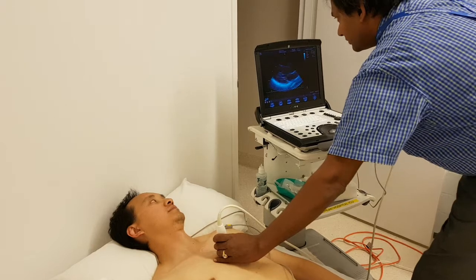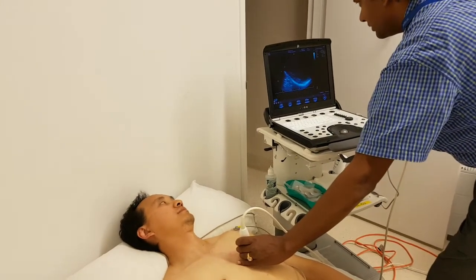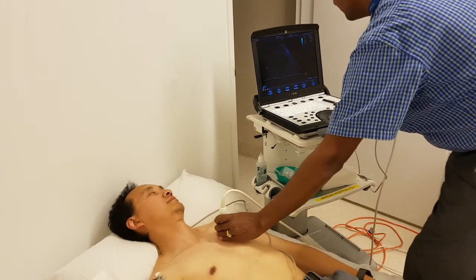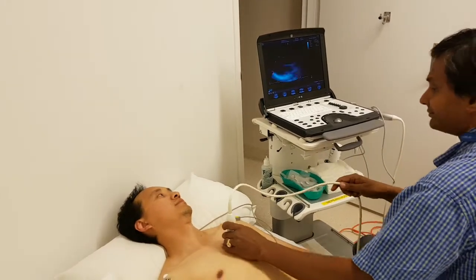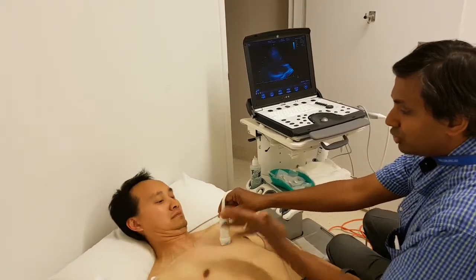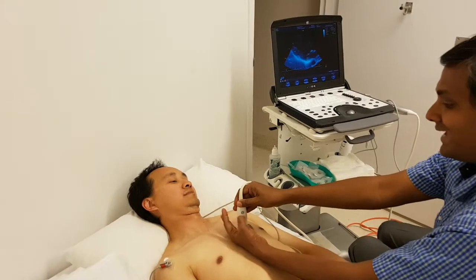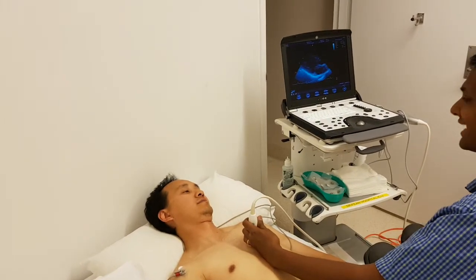Now I have much better detail. I go down until I lose the image, then come back up to the place where I had a good view. I forgot to say how I hold the probe. The way I've been taught is to hold the probe between two fingers and stabilize it with the other fingers. These two fingers hold the base of the probe and rest on the patient's skin, while the other fingers stabilize the probe — this gives a good amount of stability so the probe won't move.